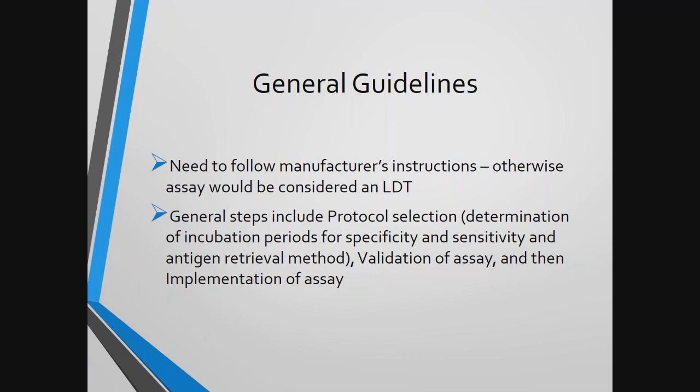Any modification to the assay will force the test into the LDT, or laboratory developed test, category, and with that will require different elements of compliance. The general steps of validation and verification include selecting the protocol, validation of the assay itself, and the implementation of the assay. The selection of the protocol includes determining all of the incubation times of the testing. This usually takes some back and forth between the technical and pathology teams in order to determine the best protocol for the tissue and antibody being validated.